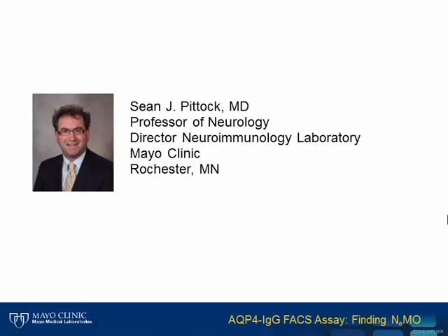Dr. Pittock introduces a new FACS assay for detection of AQP4-IgG discovered in that lab, which is required for the diagnosis of neuromyelitis optica spectrum disorders and allows for distinction from multiple sclerosis. Thank you, Dr. Pittock, for presenting with us today.